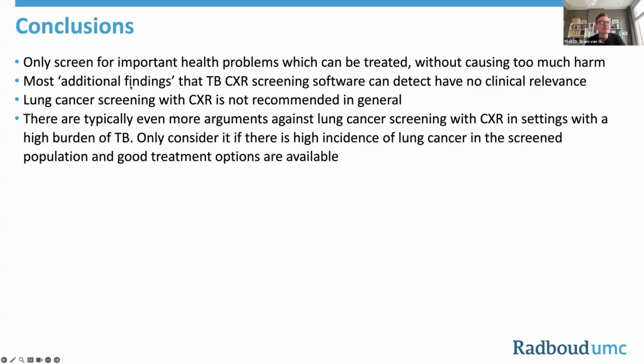So most of these additional findings that this screening software could detect have no clinical relevance, and in fact lung cancer screening with chest X-ray is not recommended in general. And given the fact that often treatment options are not widely available in areas where you do TB screening, you really should only consider looking at lung cancer, in my opinion, if you know that there is a high incidence of lung cancer in your screened population and you have treatment options available.